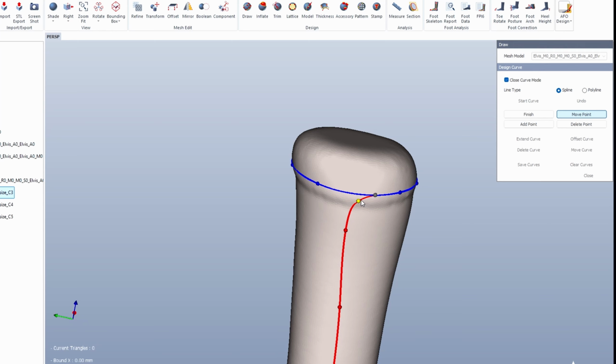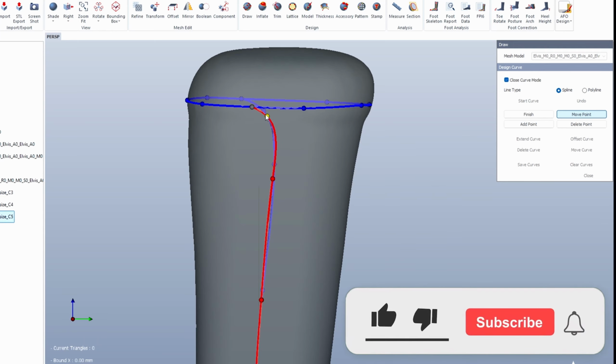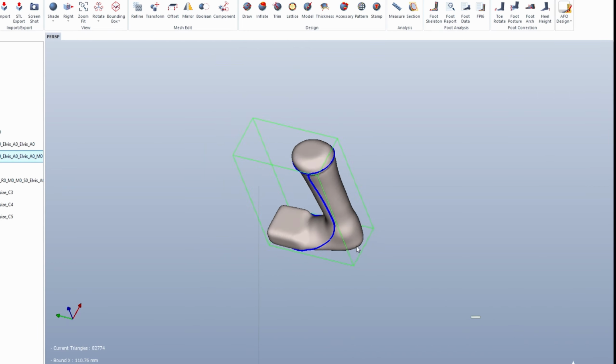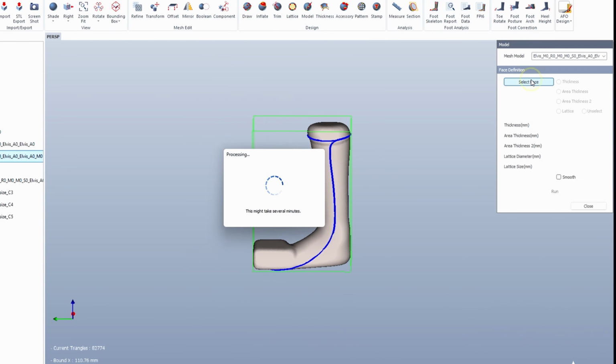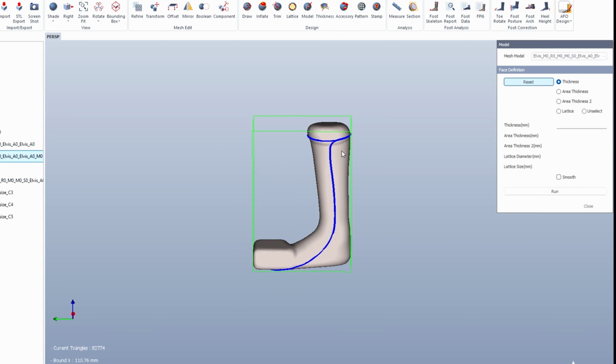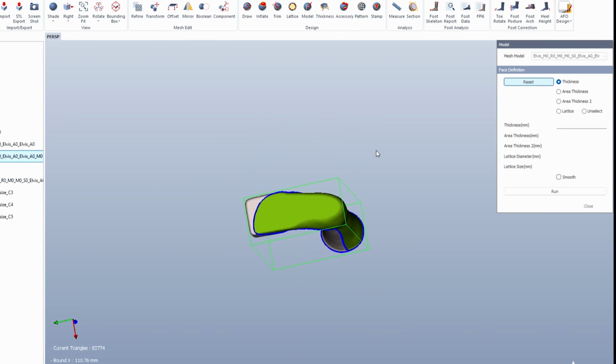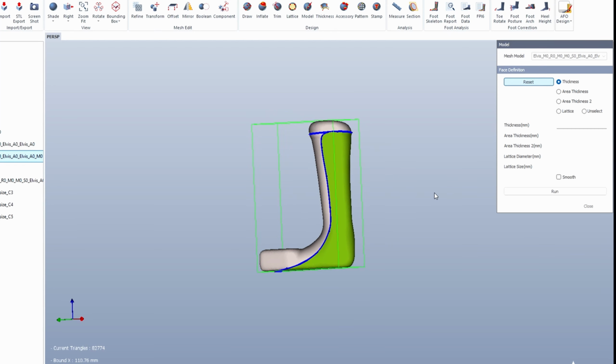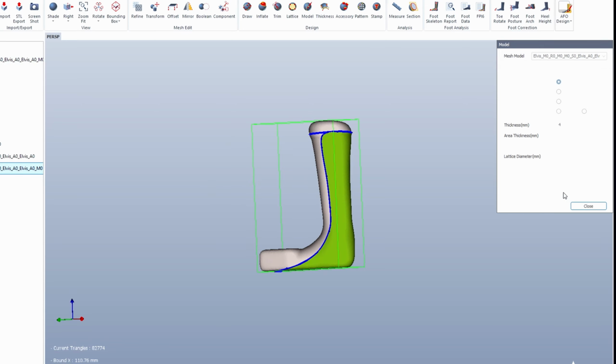Why this matters? Efficiency. Digital AFO design drastically reduces the time and labor involved in traditional casting and manual fabrication. Precision. Digital tools offer consistent, repeatable results with high accuracy. Scalability. The final model can be 3D printed, enabling scalable production and quicker turnaround times.